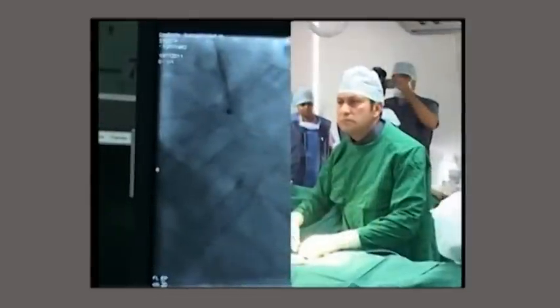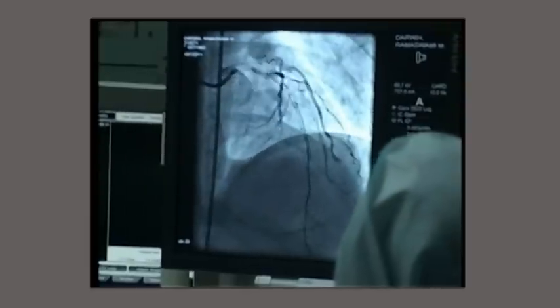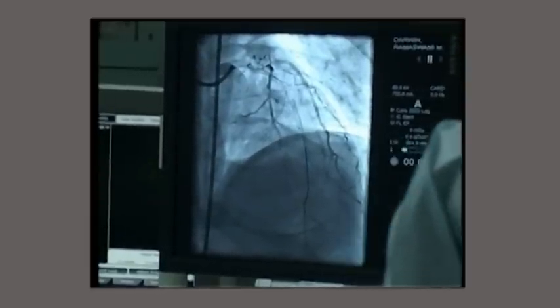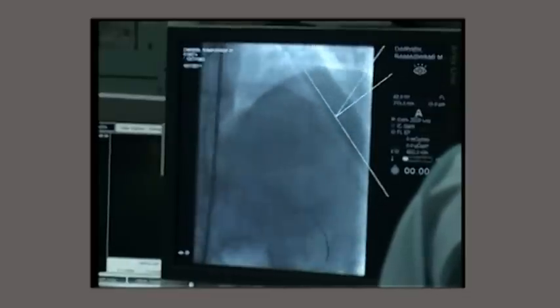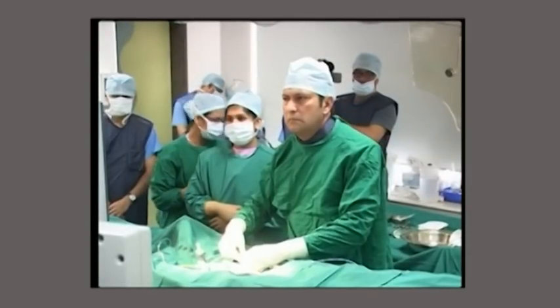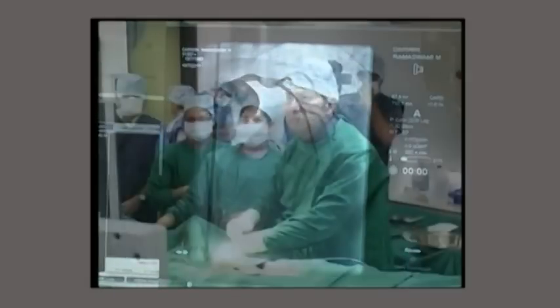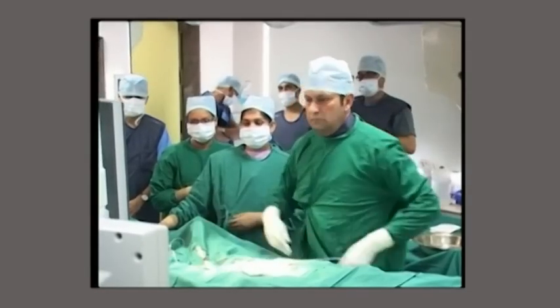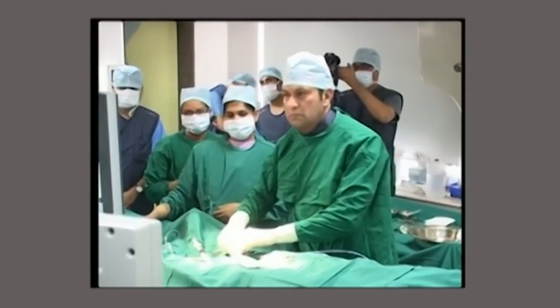I crossed the stenosis with a BMW wire, and you can see the BMW wire distally placed in the LAD artery. This is a check shoot to confirm the BMW wire is well placed distally in the LAD artery.